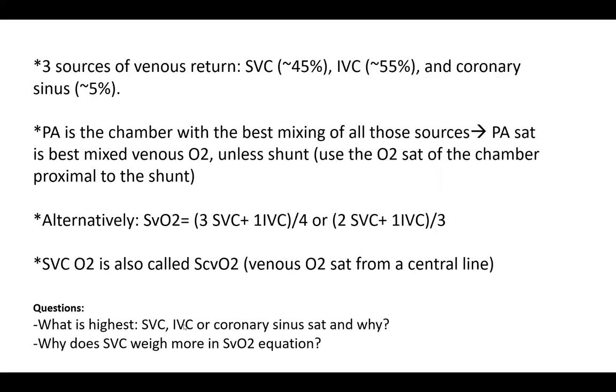So a lot of the patients we cath, IVC sat will be lower than SVC. And this is another case where this equation becomes totally useless. In those cases, if anything, you should give more weight to the IVC. So in shock state, you should not use those equations. You should probably use 1+1 or even 2+1, 2 IVC plus 1 SVC. So keep that in mind too.